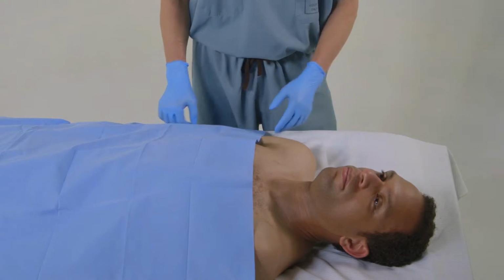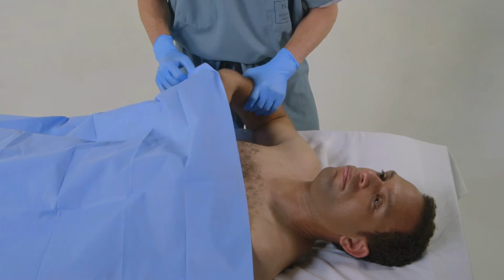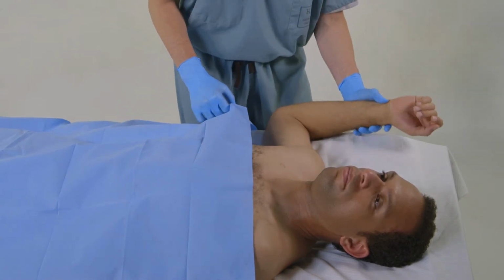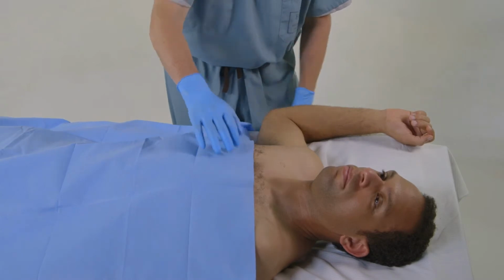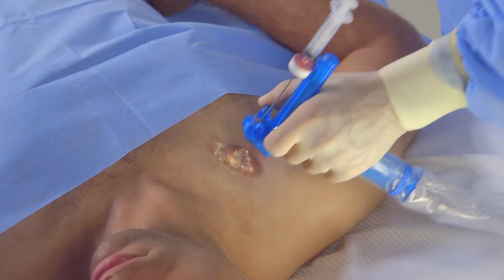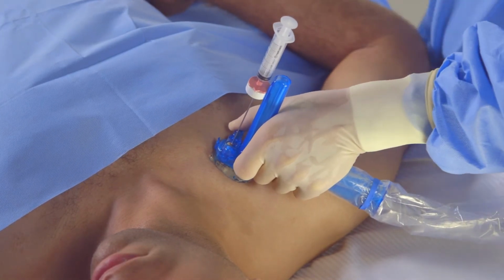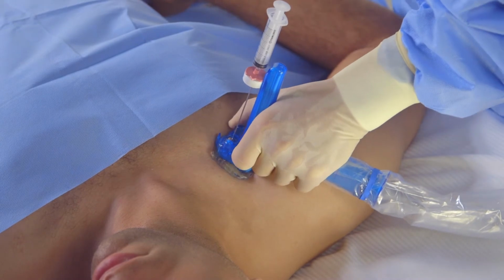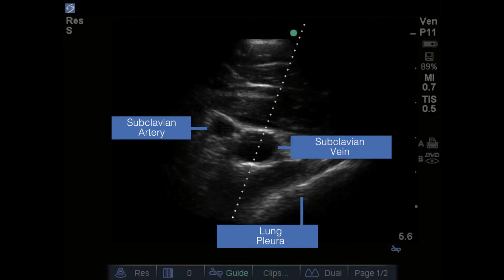To begin, it is often helpful to reposition the patient's arm to find the best view of the subclavian vein. A good starting point is with the patient's arm in the throwing position. Apply a liberal amount of sterile gel and place the probe at the angle of the clavicle and point underneath the clavicle. While still maintaining gentle pressure on the needle clamp, scan back and forth to find the subclavian artery and medial to that the subclavian vein.